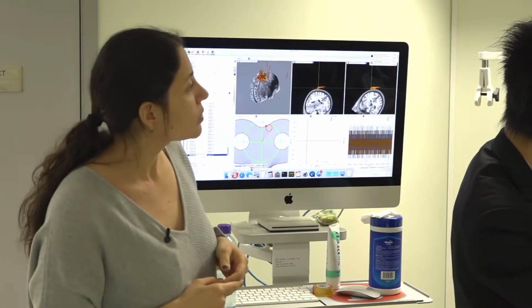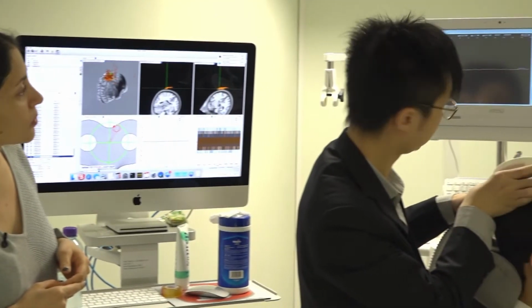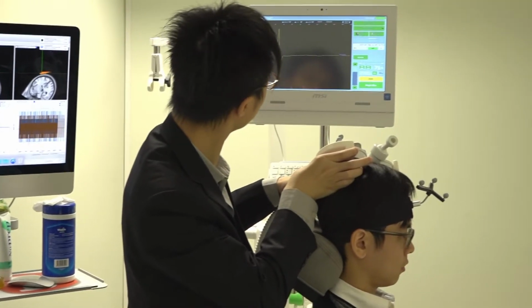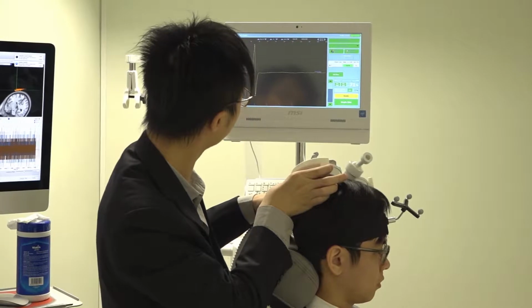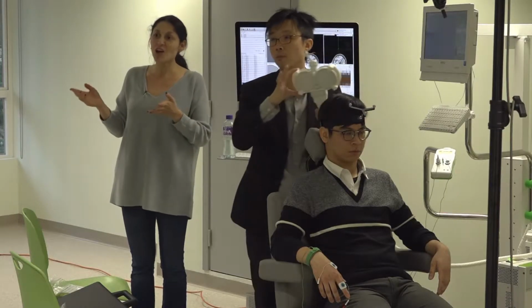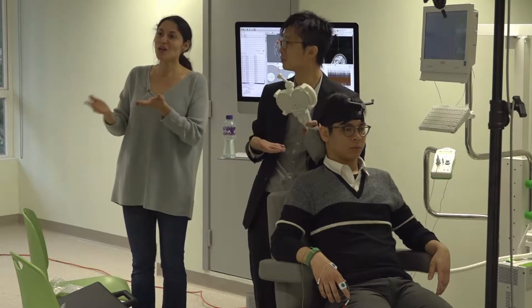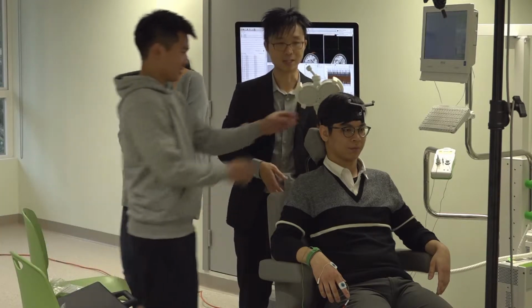Just continue, continue. Actually, that's quite stable. That's a quite good spot. Although he is far from the area where I got, and in the area where I have, I also got stable responses. Can you see how different it is? How reliable it can be? So every experimenter we have, yeah, come. Joseph is free for everybody.